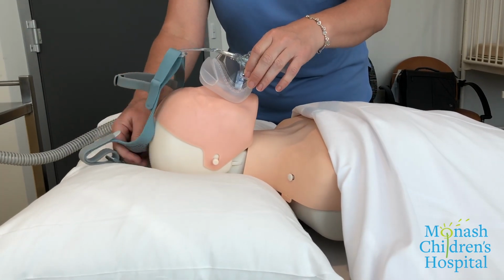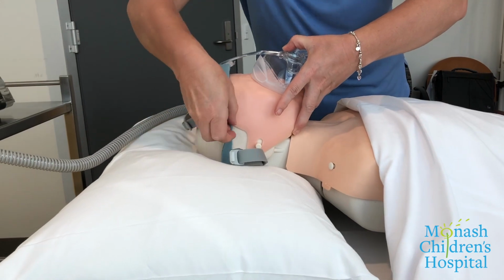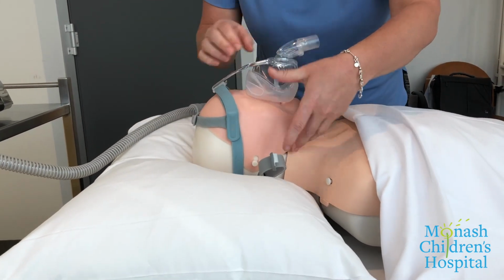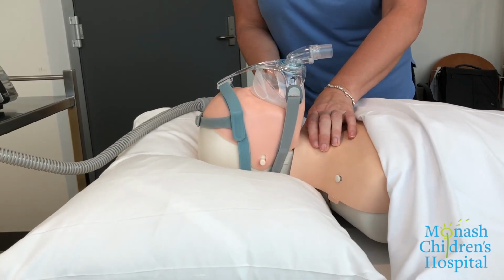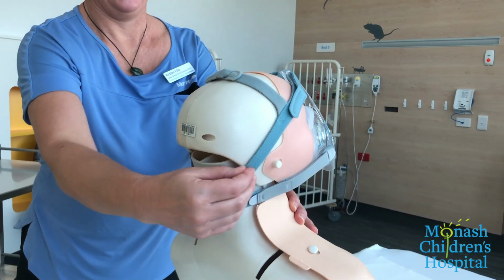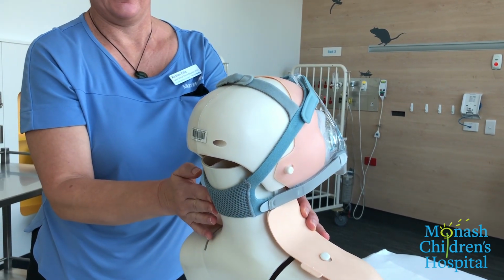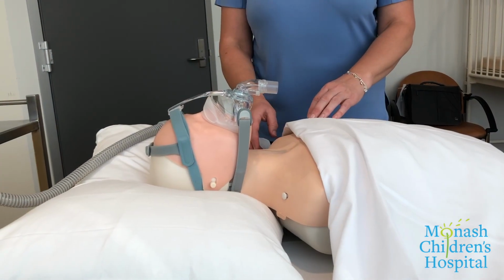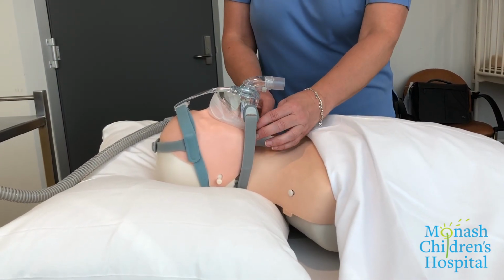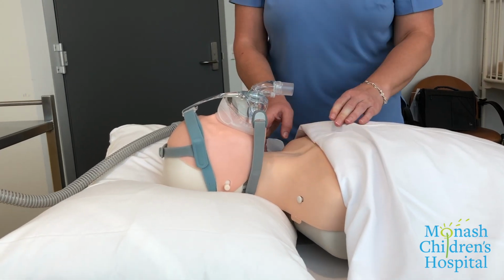Fit the mask on the child's face without the tubing connected. You may need a second person to help with this, especially for very young children. Ensure the headgear is positioned correctly around the head. The bottom strap should sit snugly at the nape of the neck. The straps need to hold the mask in position but not be too tight. A good test is where two fingers slip easily under the straps.